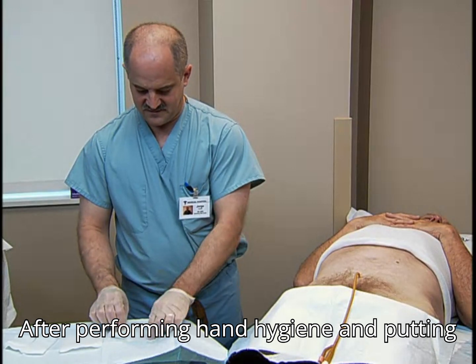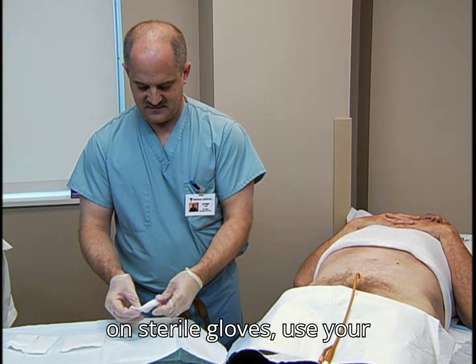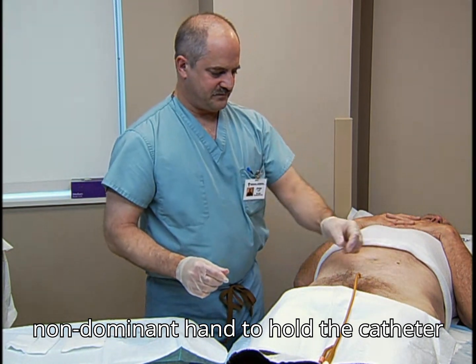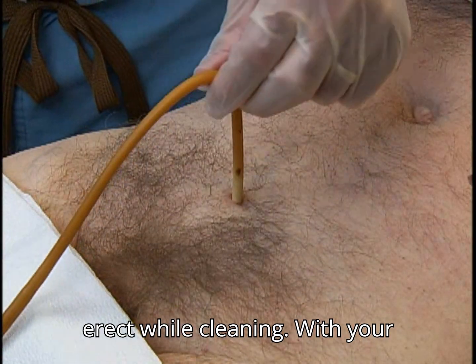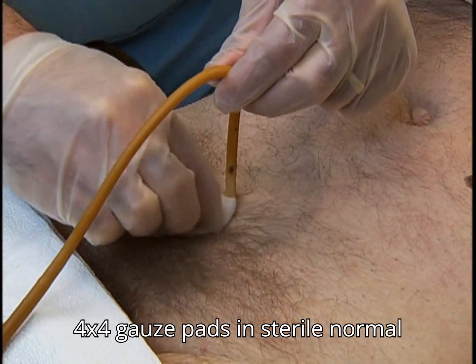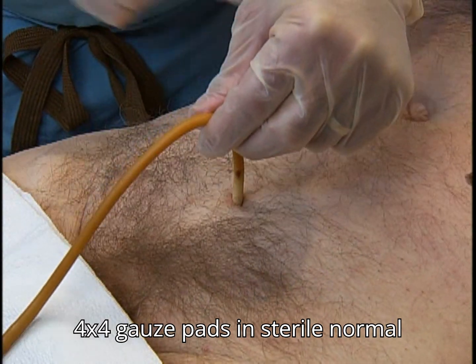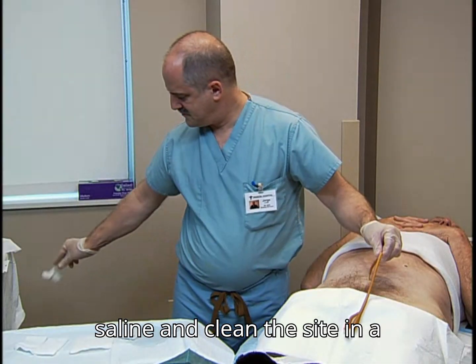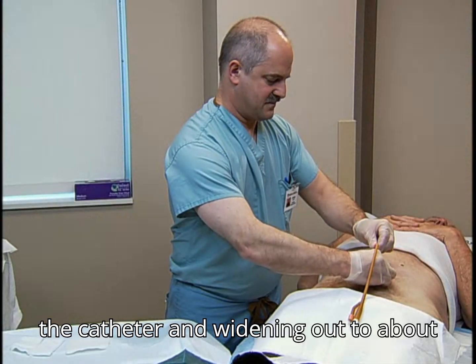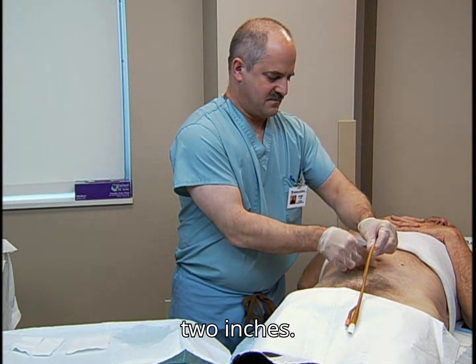After performing hand hygiene and putting on sterile gloves, use your non-dominant hand to hold the catheter erect while cleaning. With your other hand, moisten several sterile 4x4 gauze pads in sterile normal saline and clean the site in a circular motion, starting closest to the catheter and widening out to about 2 inches.